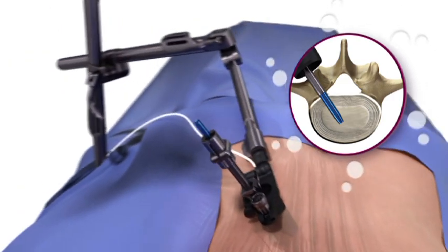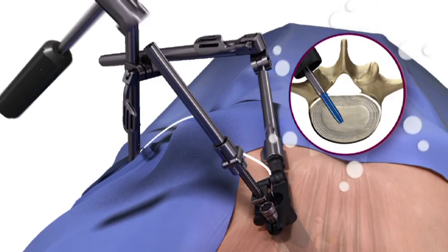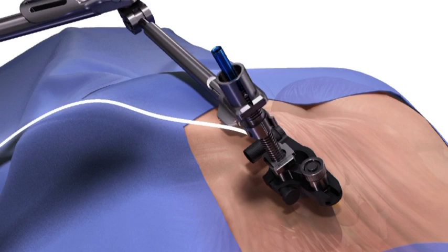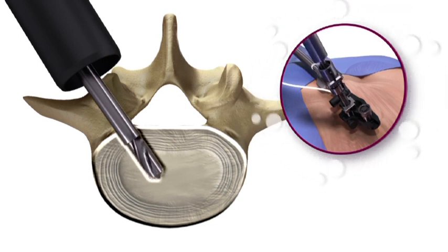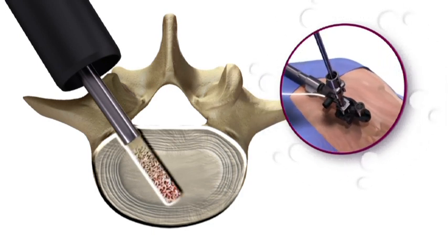Position the access portal approximately 5 mm into the disk. In this position, the access portal now serves as the neural retractor. To initiate the discectomy, a drill is used to create an operative channel in the disk. Regulating the depth of penetration is done with an adjustable stop on the proximal end of the access portal.